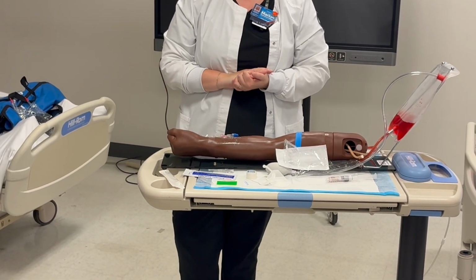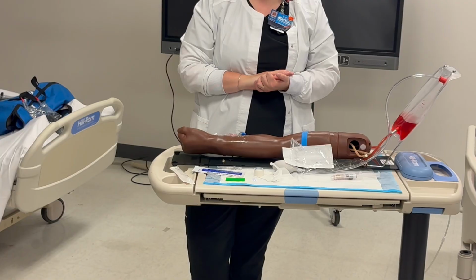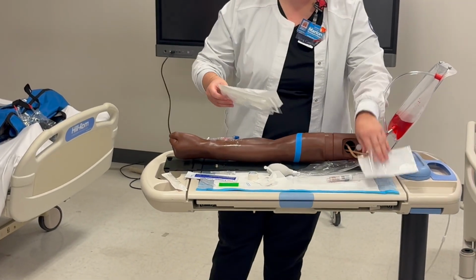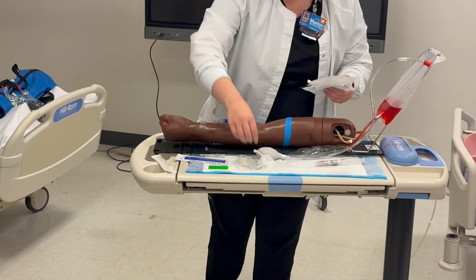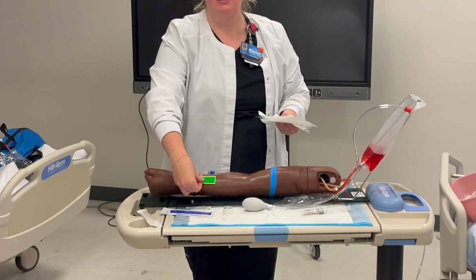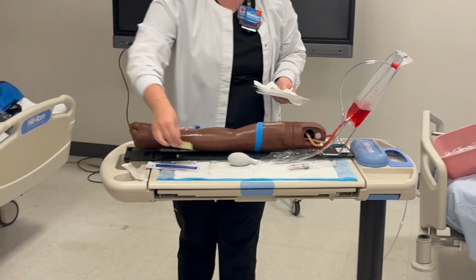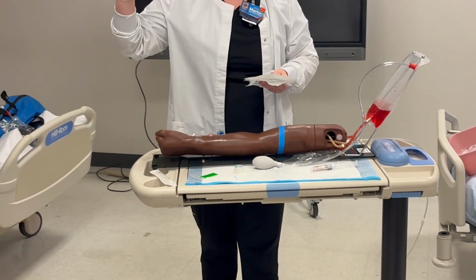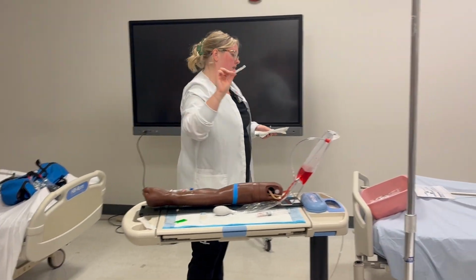Does anybody have any questions? Okay. All right, but we're not done. So, get this stuff out of the way here. And your labels, you can say in the checkoff, and then I would label date, time, and initials. You don't have to actually stick this on the patient. So we're gonna keep our pieces and parts. Where does this need to go? Sharps container.